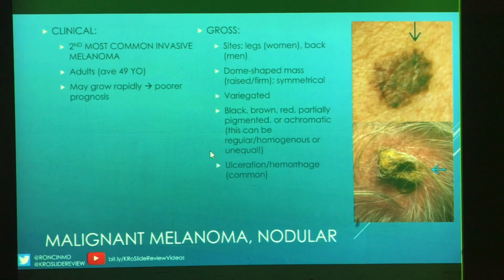So it's hard really to make out what's happening in the scalp of that second lesion, because it almost kind of looks like there's some squamous components, but it doesn't quite look like an eschar, so I'm not entirely sure what's going on there. It doesn't look right. It doesn't look right. Okay, so that's something you'd want a biopsy.